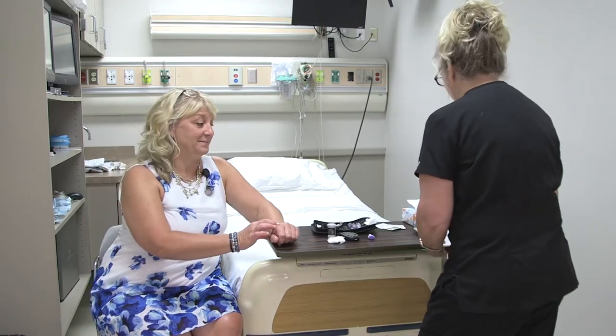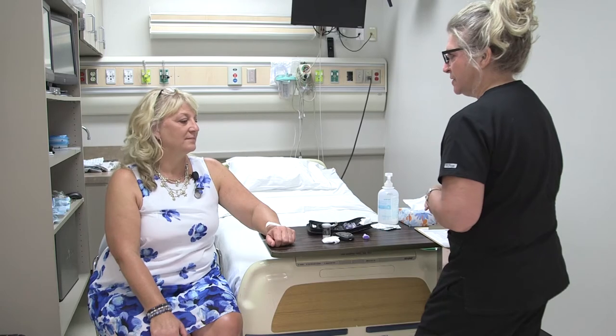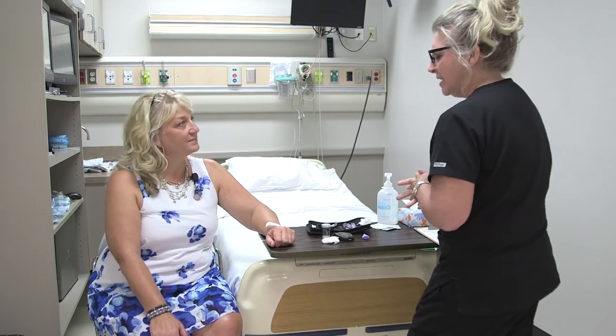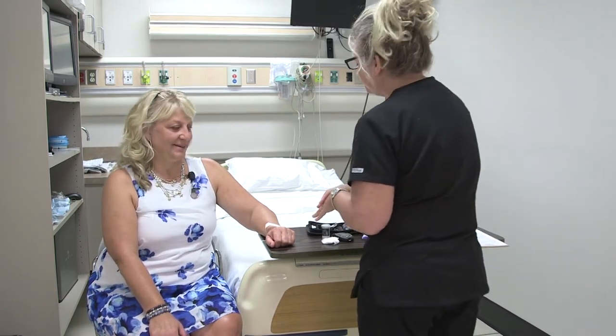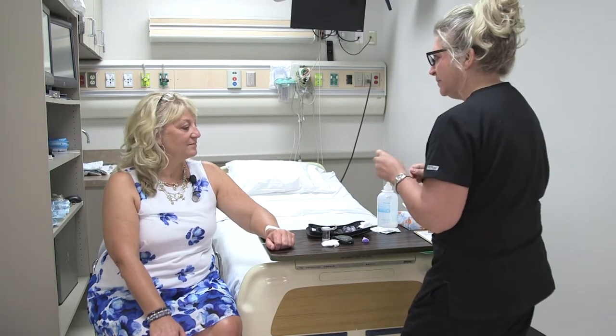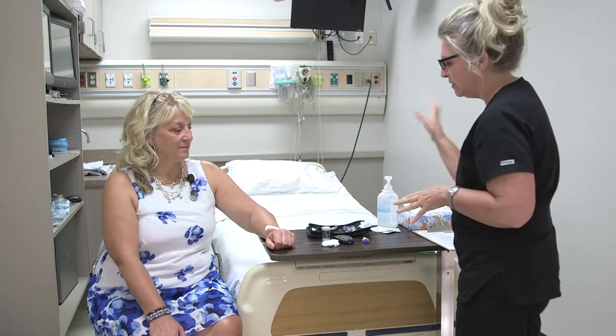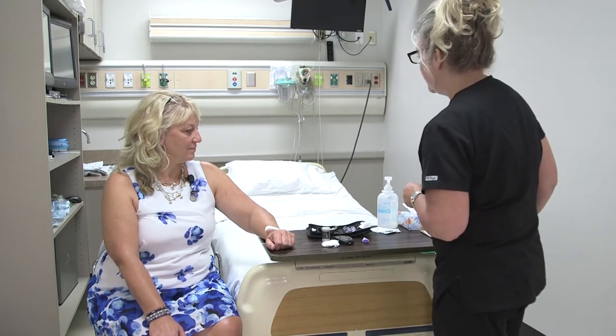I understand that you are a diabetic — correct? Yes. So that is why we are going to go ahead and check your blood sugar this morning. You've already washed your hands, but I will be using an alcohol wipe just to clean the surface before we check. And as I'm in here I'm just scanning the room making sure everything is safe.